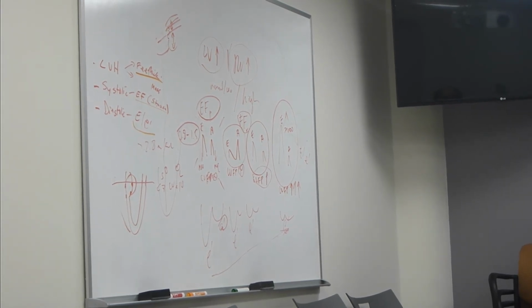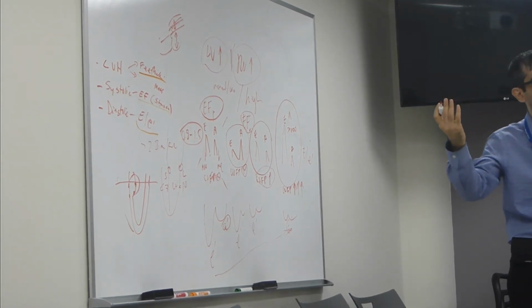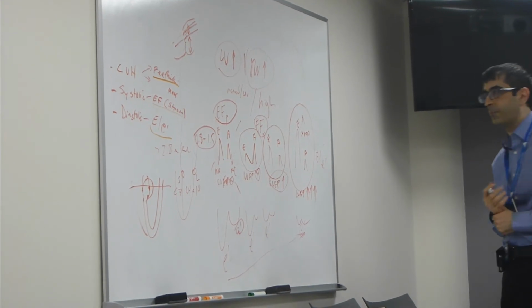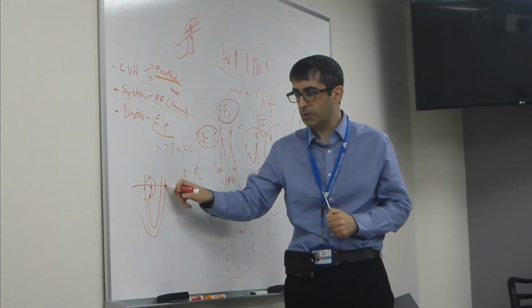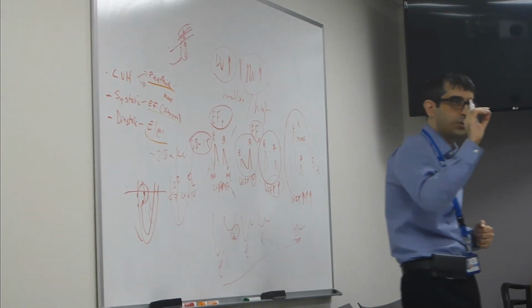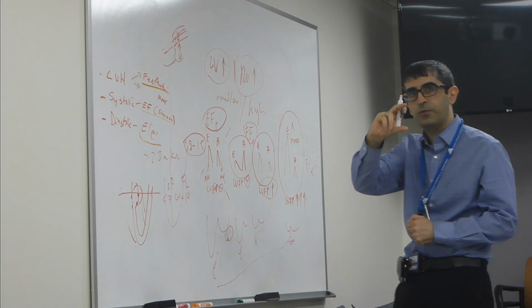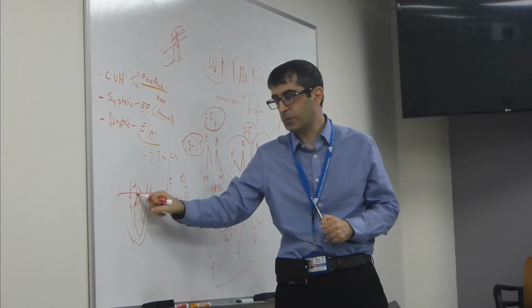Because if the reviewer comes back and asks, but what about the septum? Why didn't you measure the septum? Then we'll say, okay, well, we have the septum and the posterior wall. And he'll show you how to measure it correctly. Sometimes in the parasternal view, you see the papillary muscle coming off, so you have to tell where the wall is and where the papillary muscle is, so you won't measure the papillary muscle and make the wall artificially thick. And he'll show you how to measure the septum correctly.